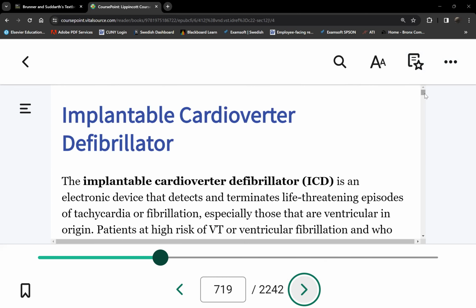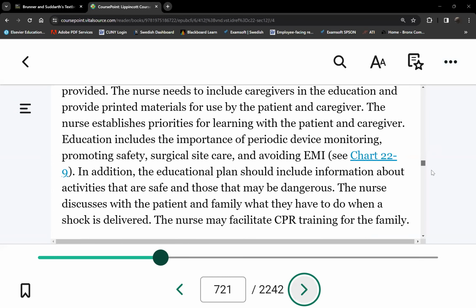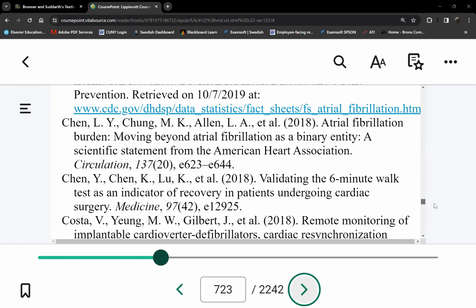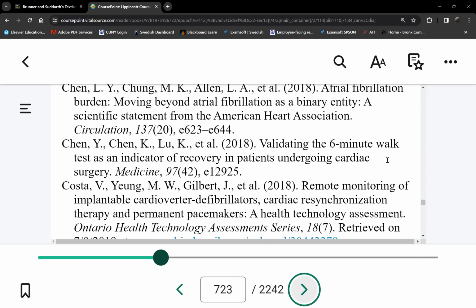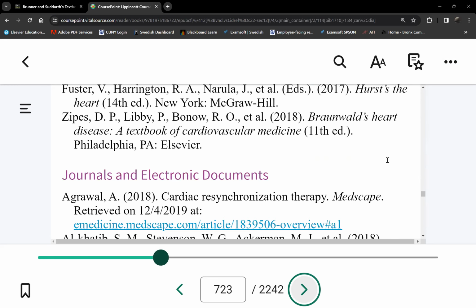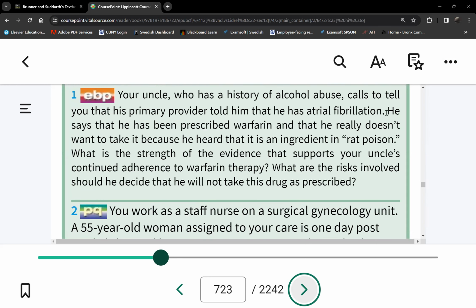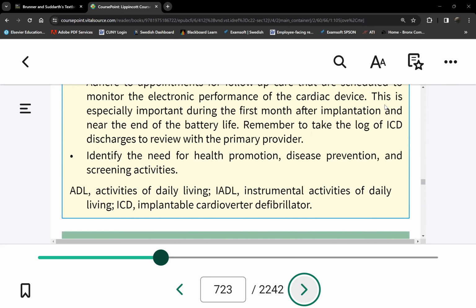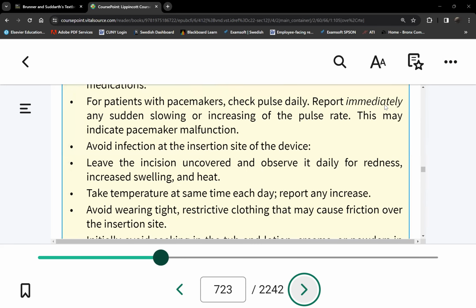Let's say a non-invasive procedure like a colonoscopy. Would the heart rate drop? No. It's usually not affected unless you give drugs. I mean, it won't, because the pacemaker is in charge. It's not going to be affected by drugs anymore because of the device. Once the device sees that the rate drops, it fires.